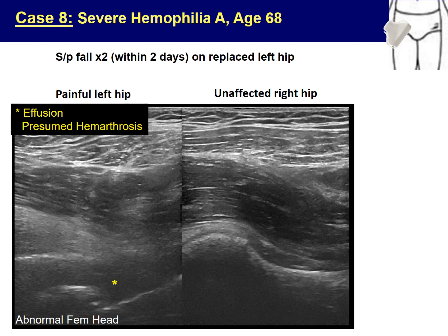We would have liked to confirm muscle and/or joint bleeding in this patient with advanced MRI or CT scanning, but due to bad pains, the patient was unable to lie still in a specific position for prolonged periods of time. In many ways, this emphasizes the virtues of point-of-care ultrasound that can provide quite in-depth and quite informative imaging within minutes compared to complicated advanced imaging procedures.